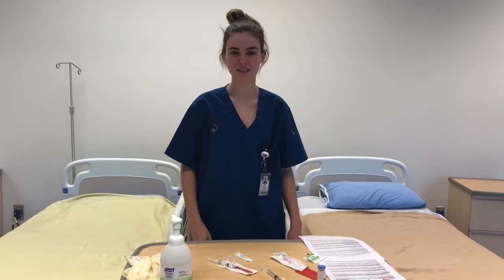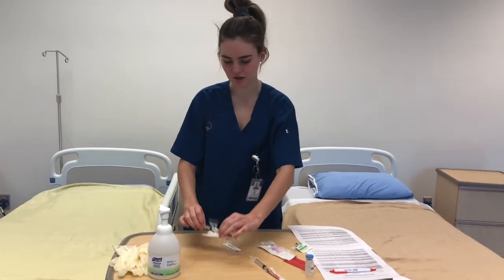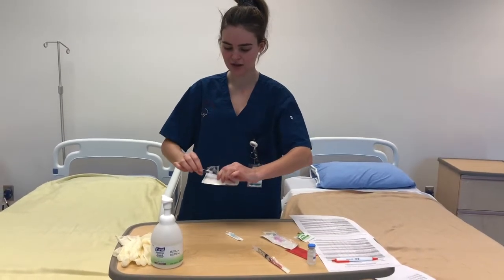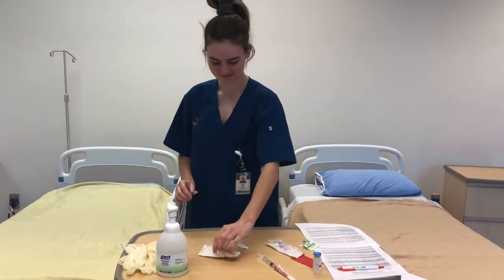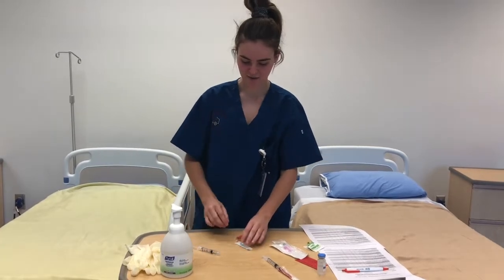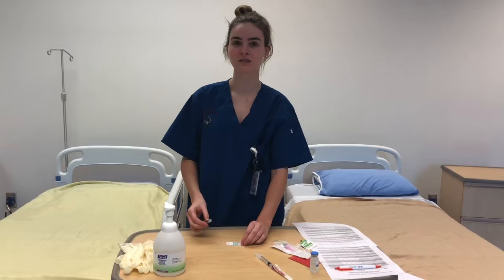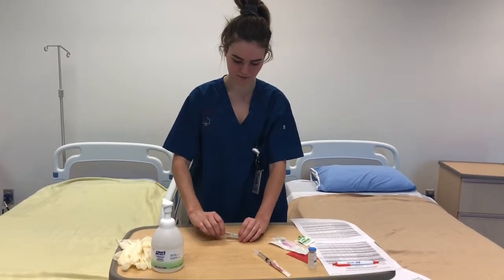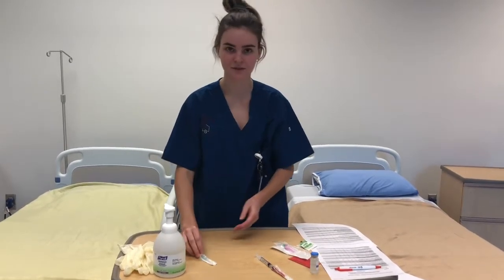Okay, so now that we are giving a subcutaneous injection to my patient, I'm going to be luer locking the needle from the syringe from the heparin medication and discarding this in the sharps container. So now that my heparin is ready, I will be luer locking it onto the appropriate needle, which is a 25 gauge needle. So now it is ready for the patient.